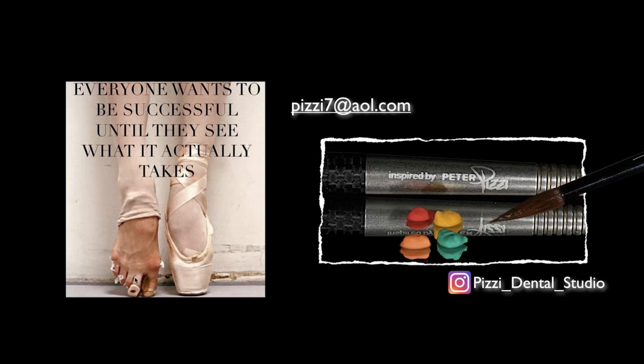We have one question on zirconia monolithic. Peter, how do you create your texture on zirconia? Do you do something before you sinter it, or do you do it after it's sintered? I'm trying to do it all pre-sinter, in green state. I'm not perfect at it by any means yet. I'm still working on it, to be honest with you.